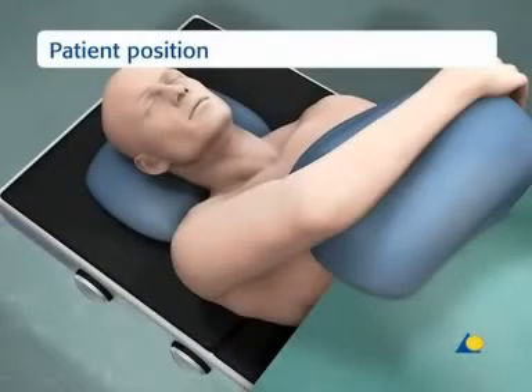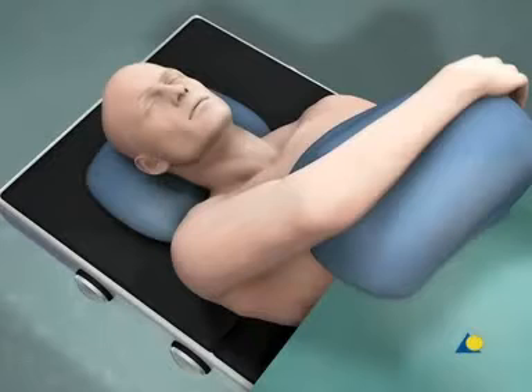The patient is positioned supine on the radiolucent table. The extremity is prepared from the axilla to the hand. This preparation allows rotation of the forearm as well as flexion and extension of the elbow during the fixation.